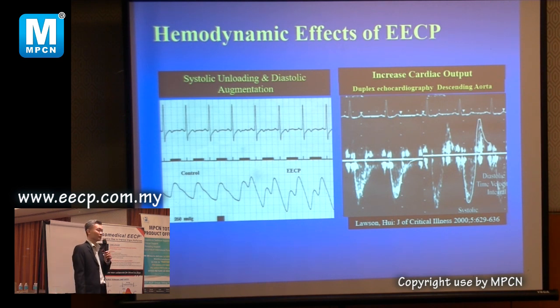Dialysis also is not recommended because of the AV fistula. Because if you burst it and you say, oh, how come it burst? Maybe it's not because of this. So all these are fine lines that you have to watch out for.